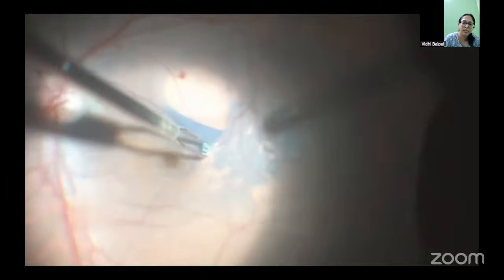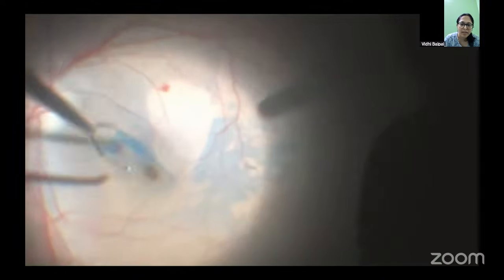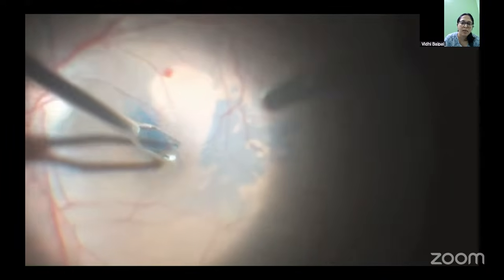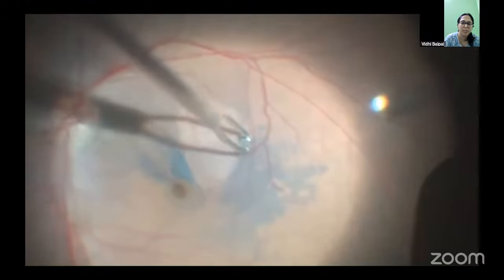So again, this technique was taught to me by Dr. Padmaja, who calls this the flower petal no touch technique. She emphasizes the no touch part of it as well. So I don't touch it at all, and then we go around and complete these multiple flaps.